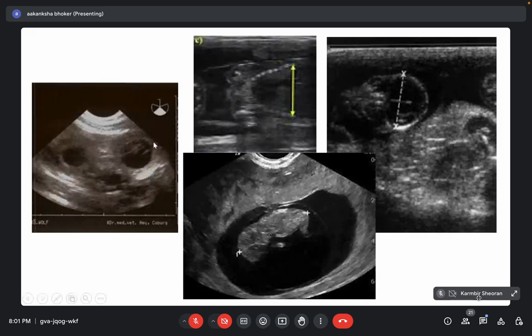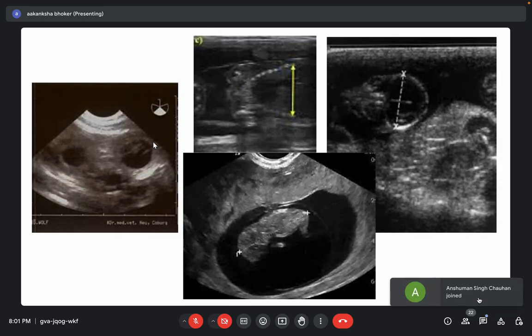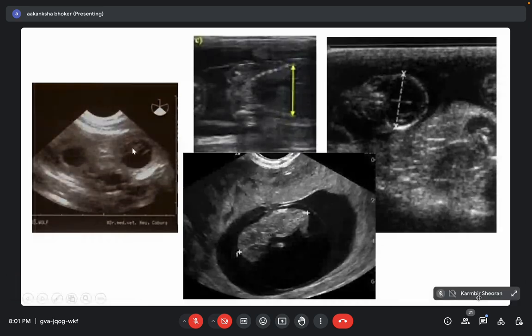If the machine already has species specific packages for performing various exams, then you just need to measure the diameter, and it will tell the gestational age and the expected date of delivery by its own. But if there are no pre-installed packages in the machine, then we can just use some standard formula from standard texts, put these values into those formulas, and get the age.